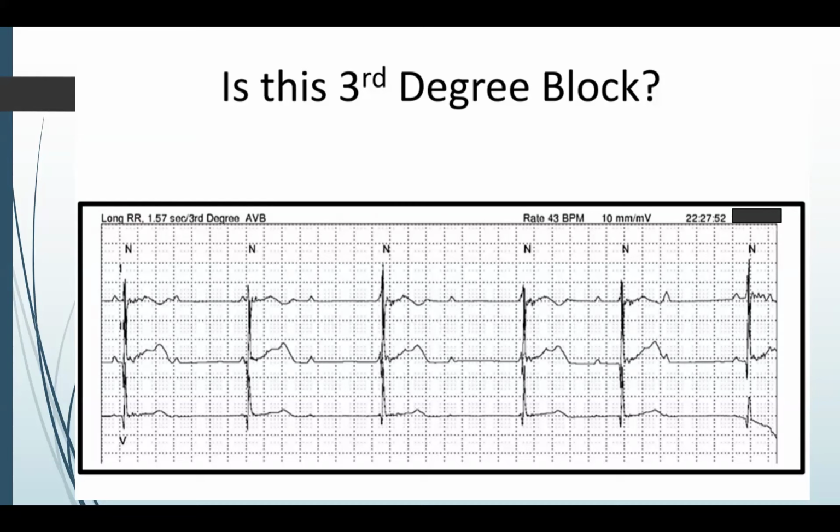Yeah, so I think this is high grade second degree rather than third degree for that reason. Yeah, I agree with you. And that's the important point.